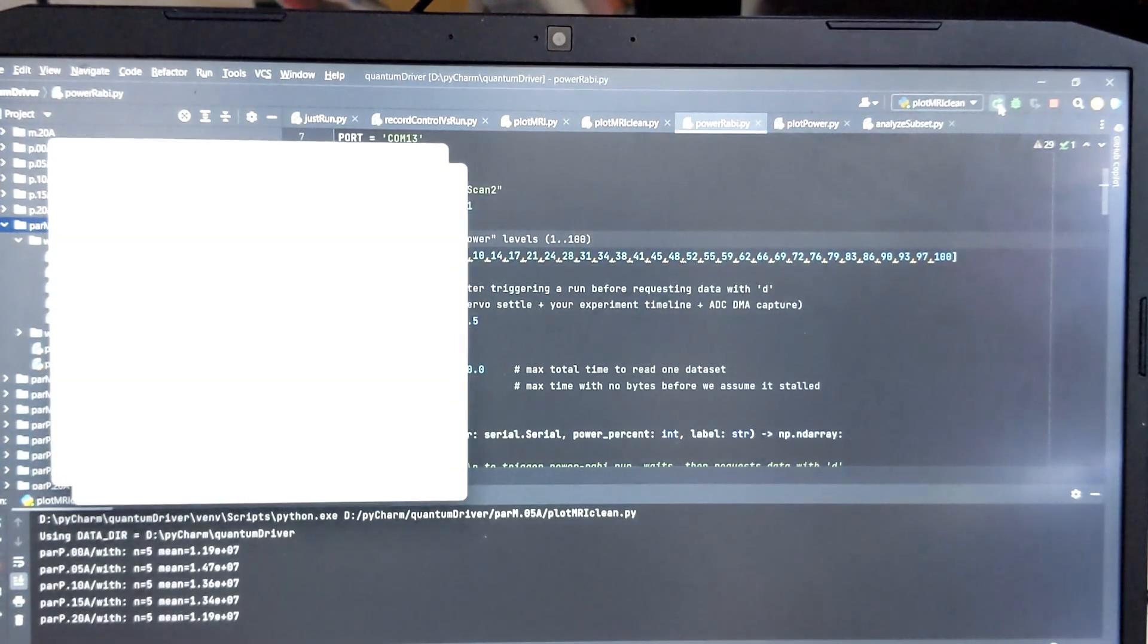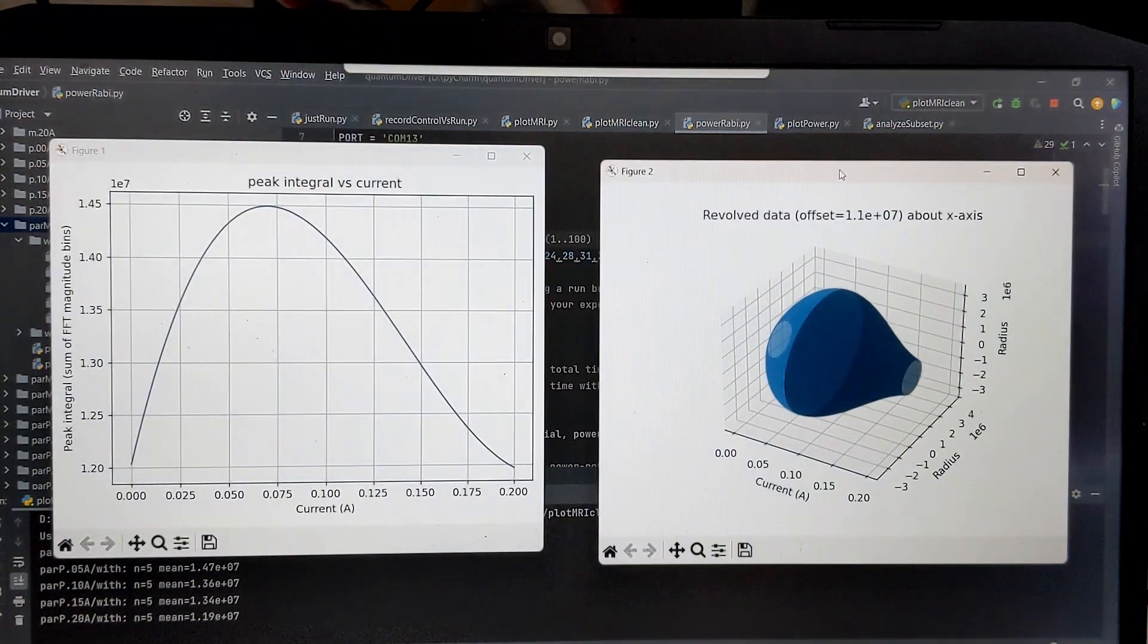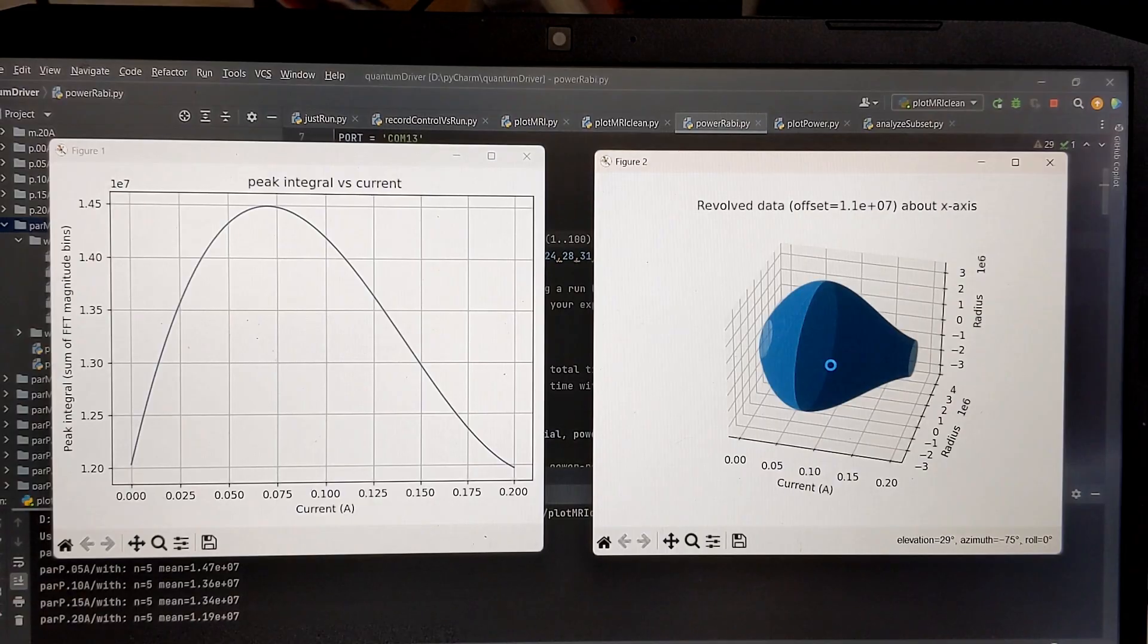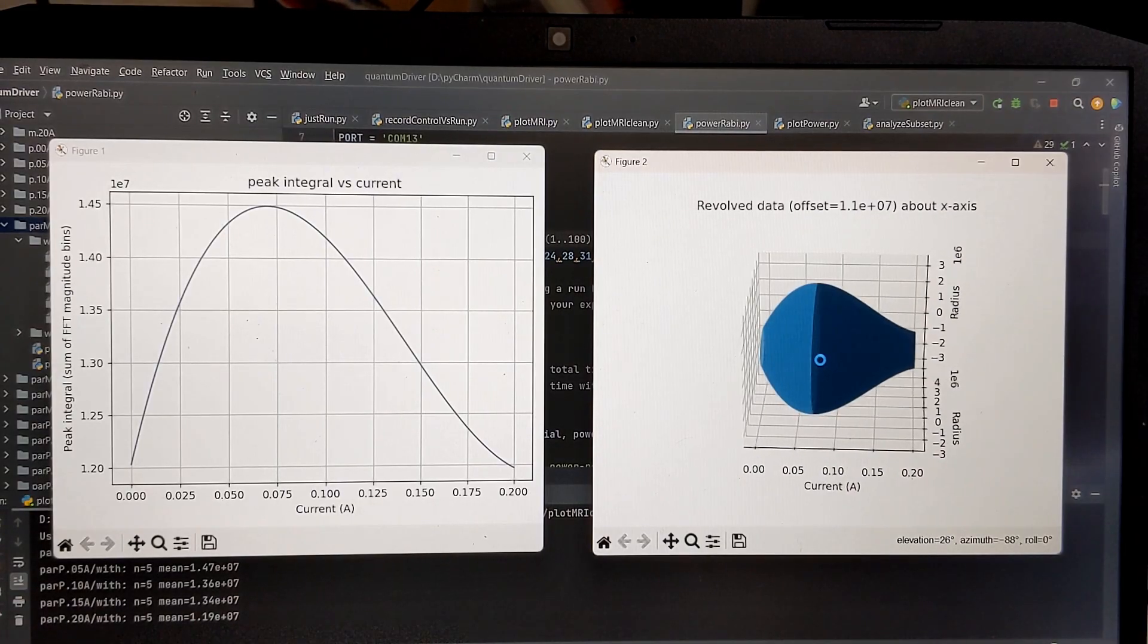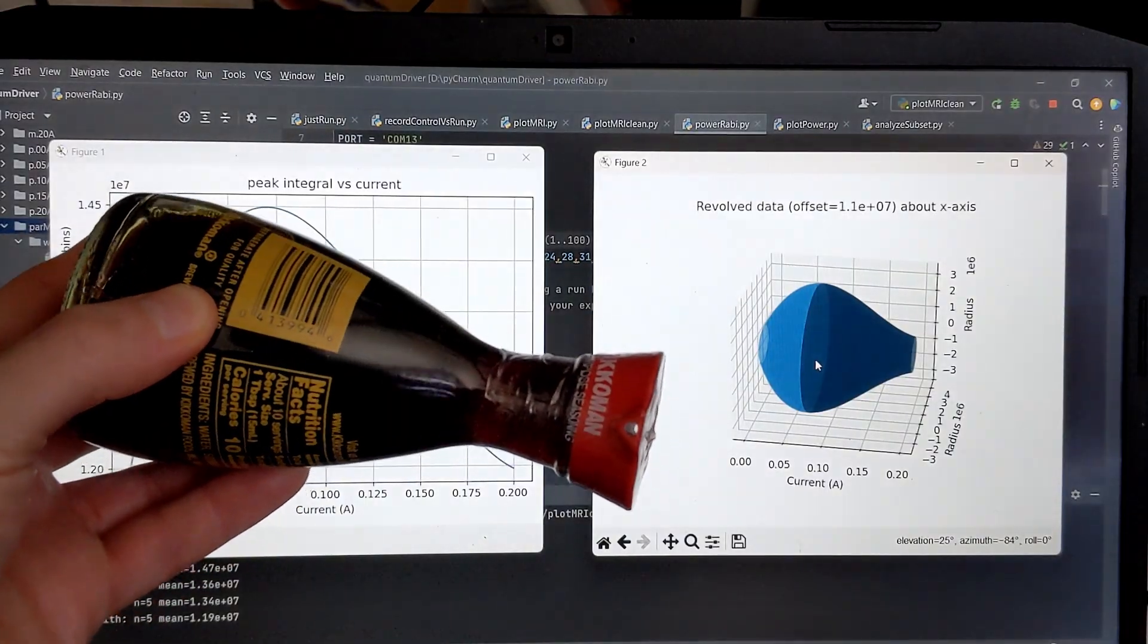All right, it took a while but we finally finished gathering all the data. This is what our data looks like, and if you take that one-dimensional data and you revolve it around the axis, we get this shape, which is pretty close I would say.